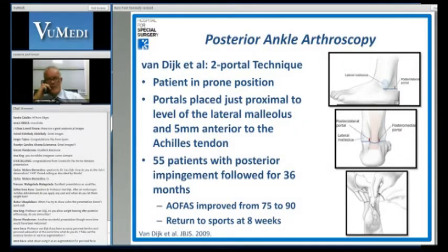And then you make your incision, being careful with the mosquito clamp in line with the first web space. I err on the side of just a little lateral to that first web space when I put the probe in. Then you introduce your trocar and a 4.0 scope, and then you make your second incision on the medial side, aiming for the scope and then downwards onto bone. And it's that old orthopedic maxim, get onto bone quickly and we can do little or no harm.